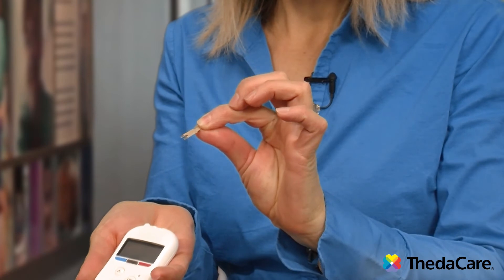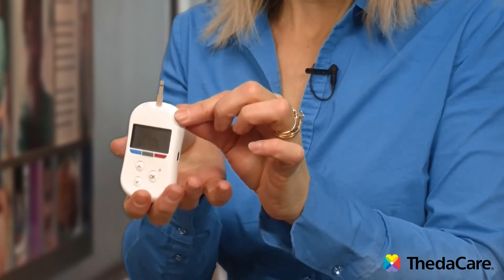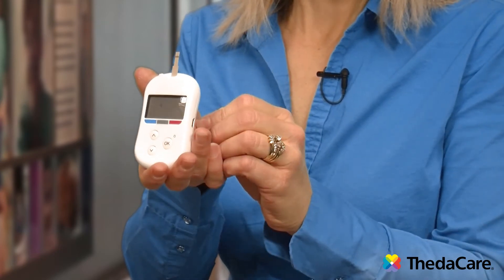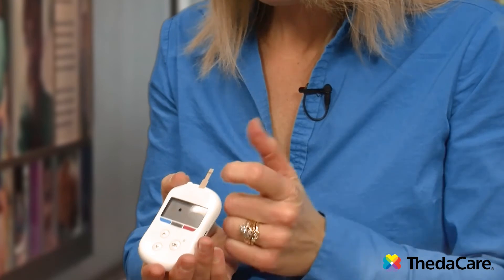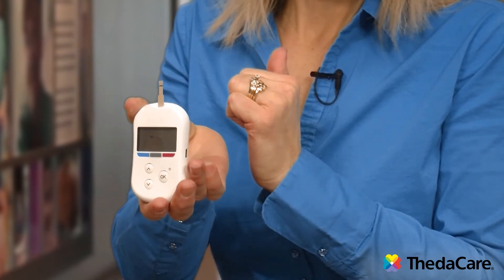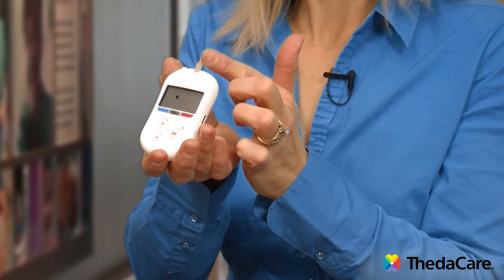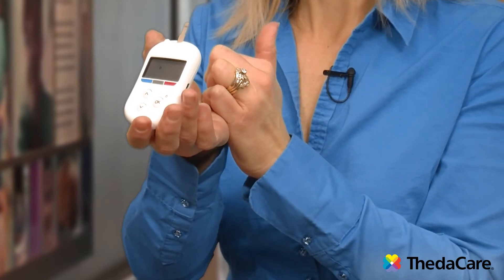I'm going to take my glucose meter test strip and stick it into the top, and the meter turns on. It's going to think for a couple seconds, and then it will show you a drop of blood icon. When you have that drop of blood showing, it says it's ready to receive the blood. On this particular test strip the line goes across, so that's where I want to place the blood. When you do place your blood on the test strip, do not place it on top or the bottom — always place it on the side or the edge so that the blood can wick between those two layers of the test strip.